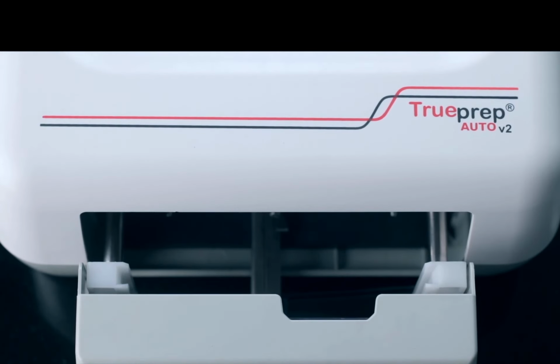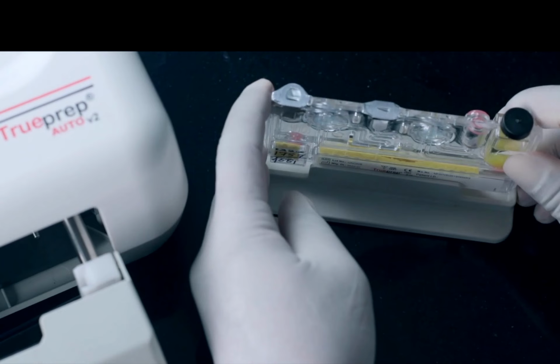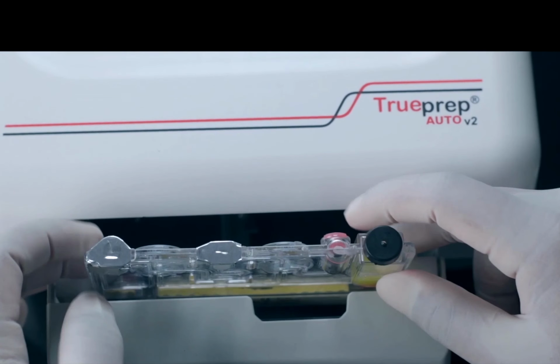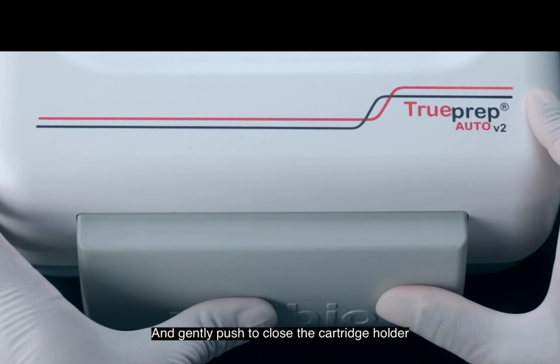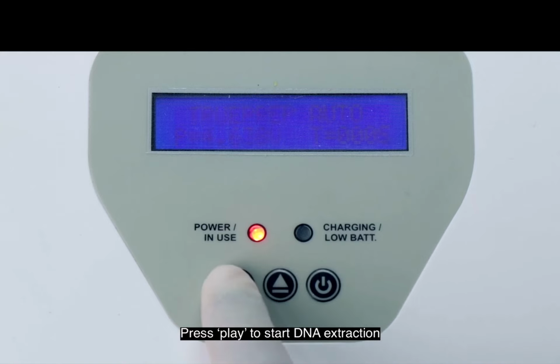Now you see it is like a tape recorder, like old time tape recorder we use. This is like a cassette to put inside. Now you see the orientation in which it is put inside. So this is the orientation. On your right side, the sample side is there. On the elute side is on the left side. You cannot put it in the other side and close it. So always be careful to put it in this particular orientation. Just see it is firmly sitting inside. Okay. Then push the cartridge door till you hear a click. Okay. Then you can just press the play button to start the process.